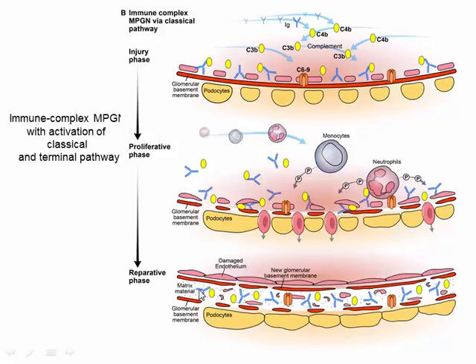But remember, you're seeing immunoglobulin, then you're seeing complement. So as pathologists, the immunofluorescence is extremely important, and it tells me what's entrapped there. Looking at the material that's entrapped in these thick capillary walls, I can tell you what the underlying etiology is. Is this an infection? Is this autoimmune disease, or is this a paraprotein or a monoclonal gammopathy? Just by looking at this material based on the immunofluorescence studies, I am able to give you an underlying etiology.